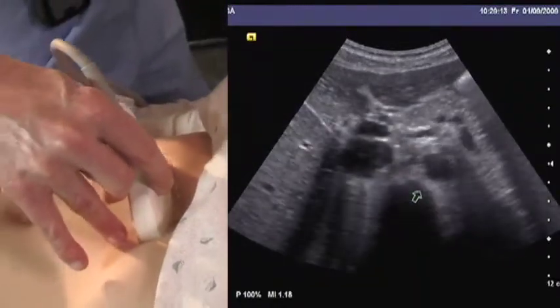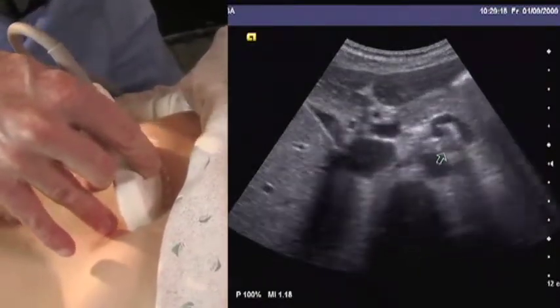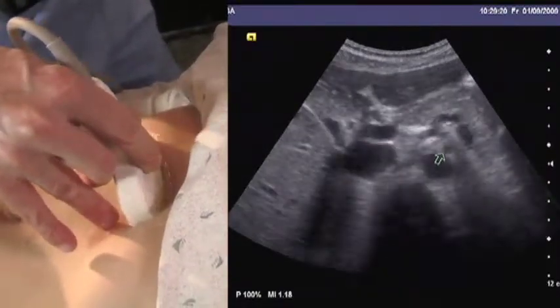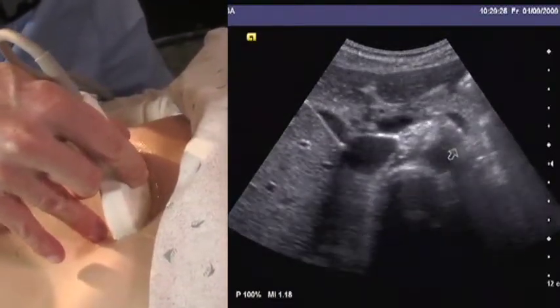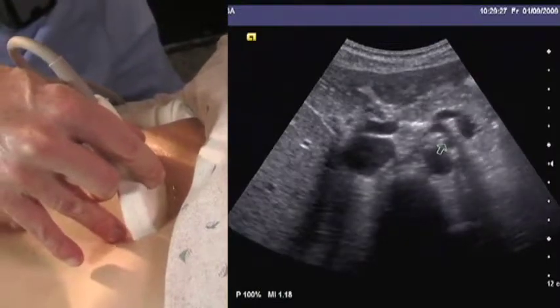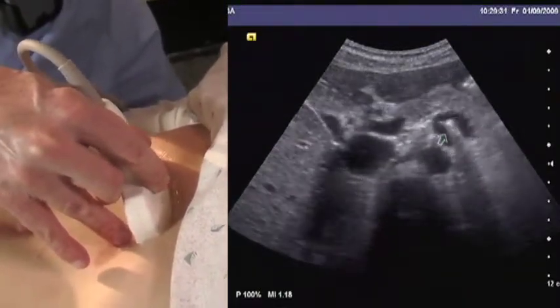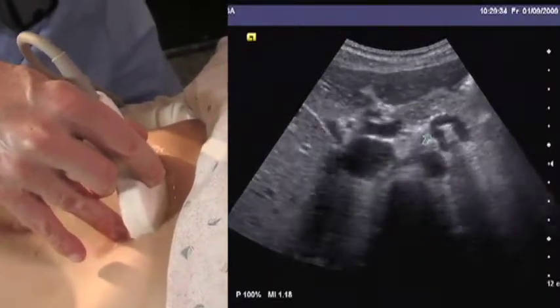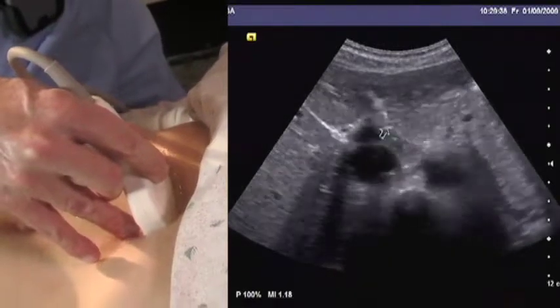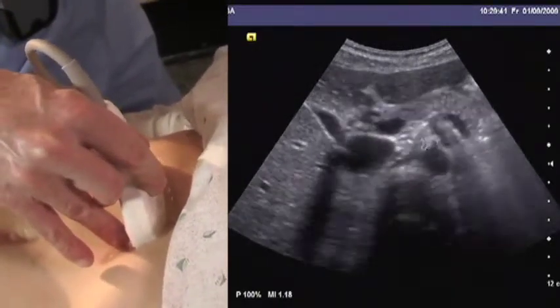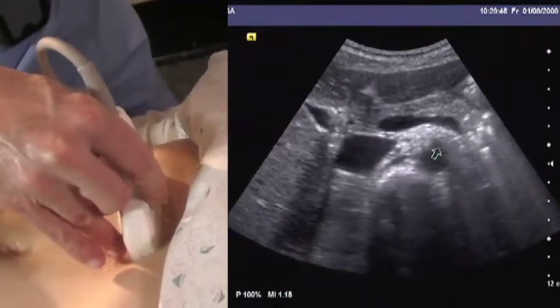Progressing steadily in a cephalad direction, the first vessel to arise from the aorta is the celiac axis, right here. The celiac axis divides into the common hepatic artery and the splenic artery — this is characteristically described as a seagull sign, though not particularly well seen in this case. The hepatic artery heads to the patient's right towards the porta hepatis.